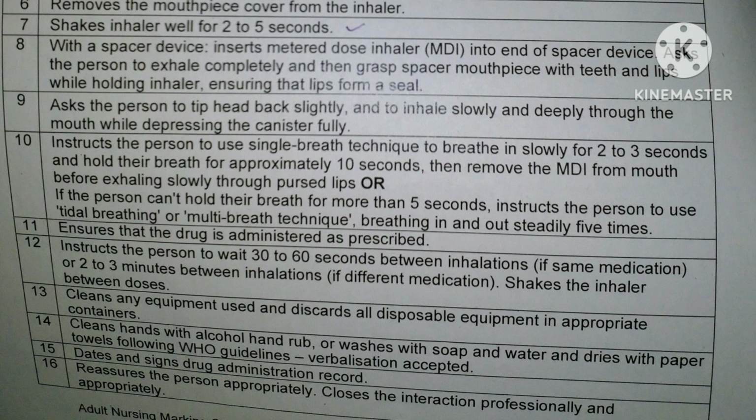Then ensure that the drug is administered as prescribed. Always make sure of the ordered dose, maybe they have ordered 200 micrograms. Maybe the available dose is 100, so that's why we are giving 2 puffs. Then instruct the person to wait 30 to 60 seconds between inhalations if it is the same medication, or 2 to 3 minutes between inhalations if it is a different medication. Shake the inhaler between the doses. This is another important thing. Don't forget to shake the inhaler between the doses.